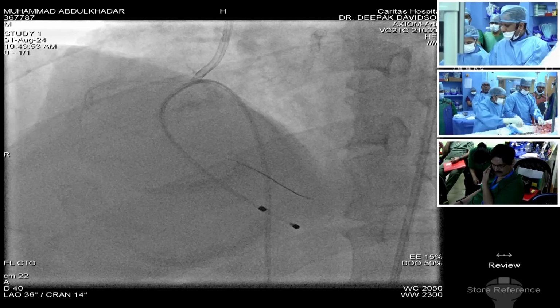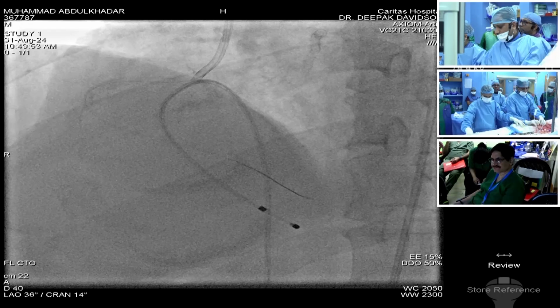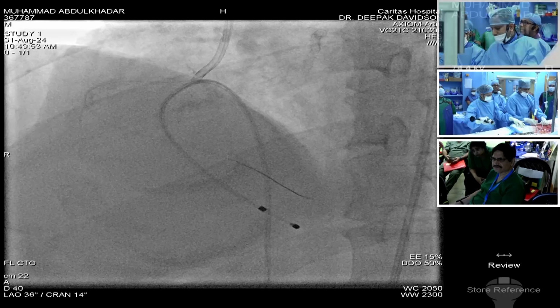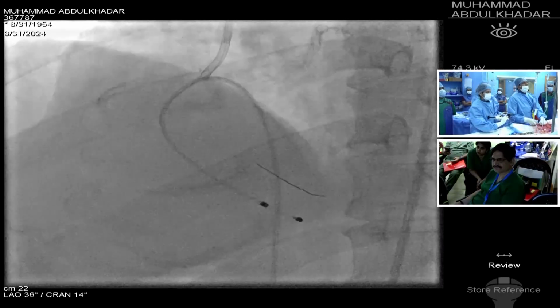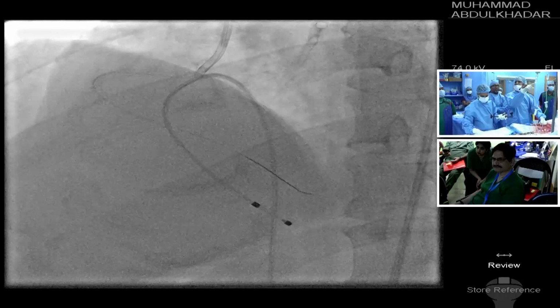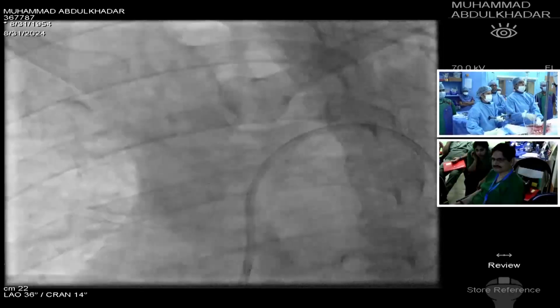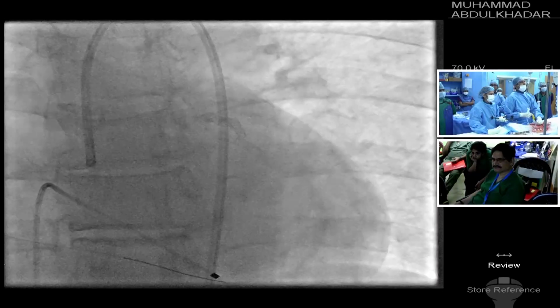One disadvantage I felt with orbital, compared with rota: once you're across the lesion with rota, you know that you've done whatever is possible. Then probably you can readjust the wire position and have a more favorable wire bias and have one more run and settle with that. But with the orbital, the end point is always difficult.